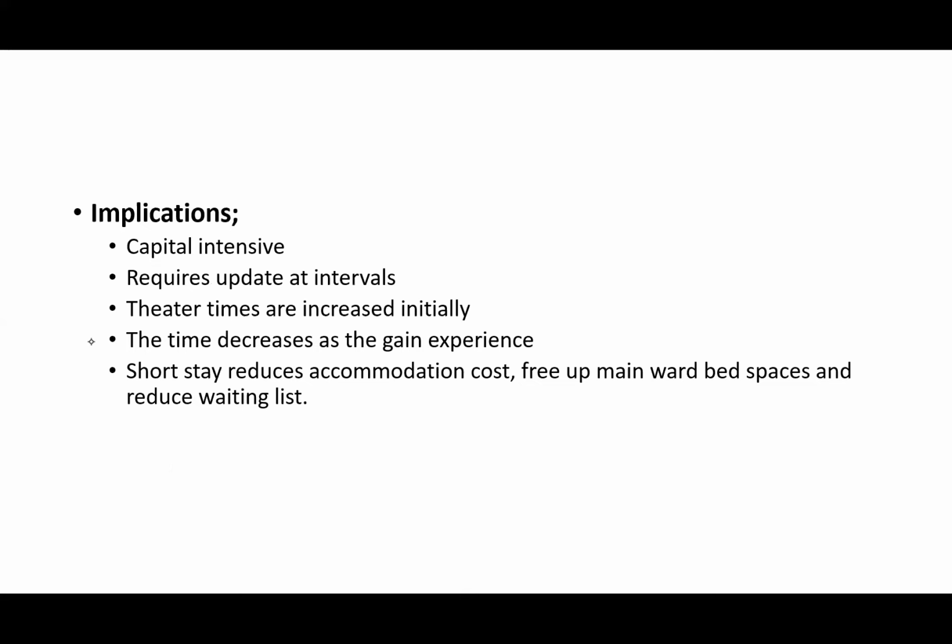Now, from all we said, what are the implications of minimal invasive surgery? It is capital intensive. These instruments are very expensive. Disposables that are used are very expensive. Upgrading of a facility is very expensive. It requires updates at intervals.